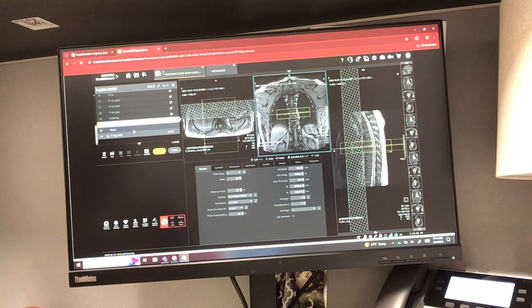Okay, so now I can go ahead and hit go. You might also see the phase going right to left. Due to some of that heart motion, maybe you'll see someone do it right to left.